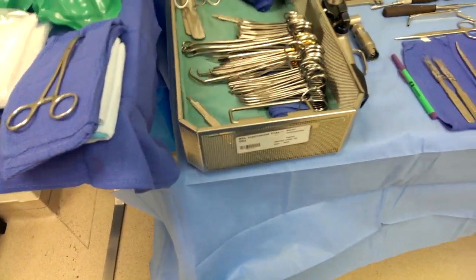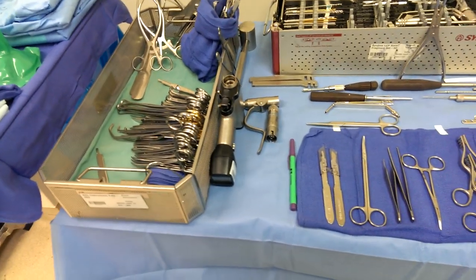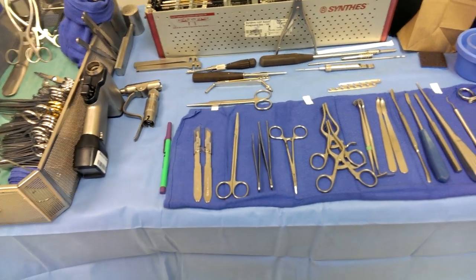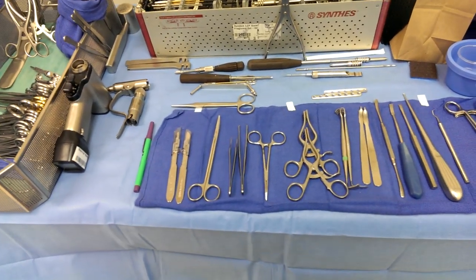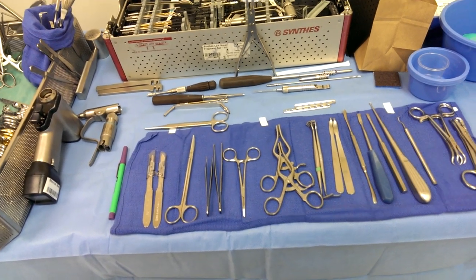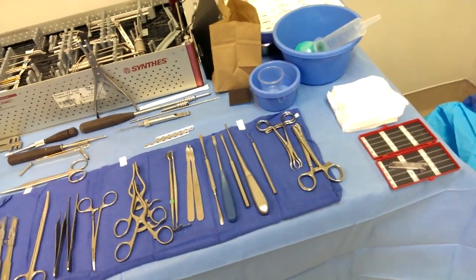You get in and you might have a fracture that you need to lag — you lag that. Have your dissection tools ready, instruments ready. And you just dissect, get down to the bone, take off the periosteum, and then start working on your plate, getting your reduction and start putting your plate on. Simple as that — as long as you're prepared and ready to go, you're set. This is my fracture setup.